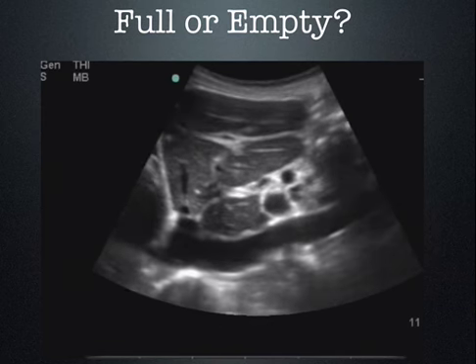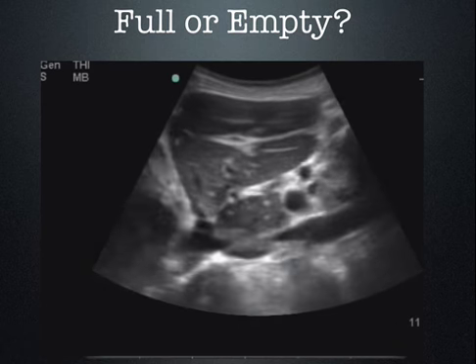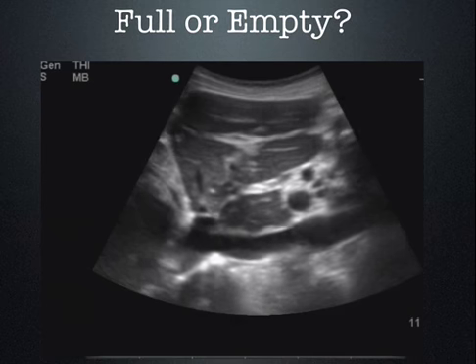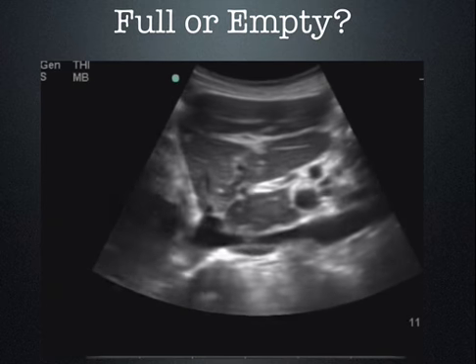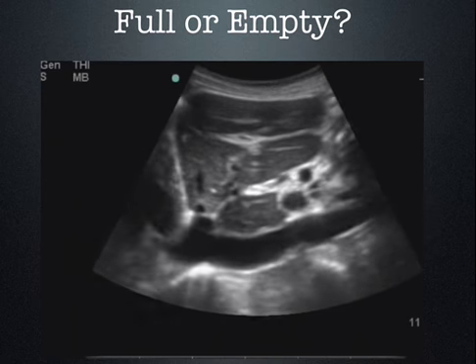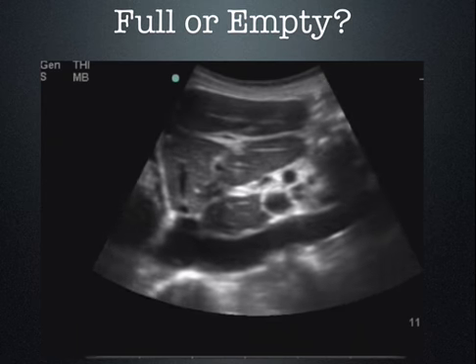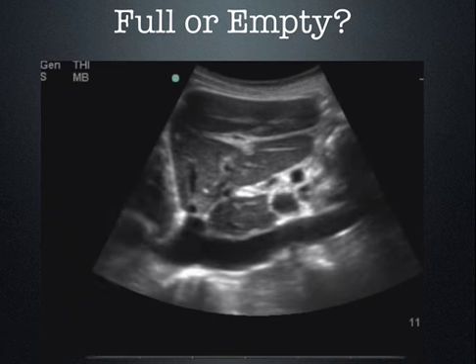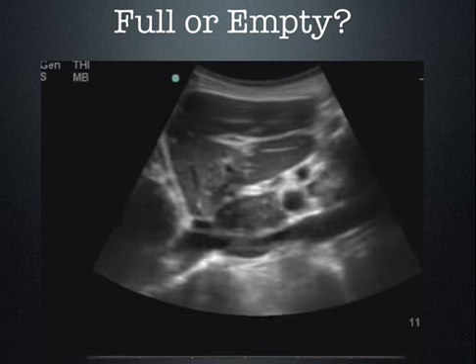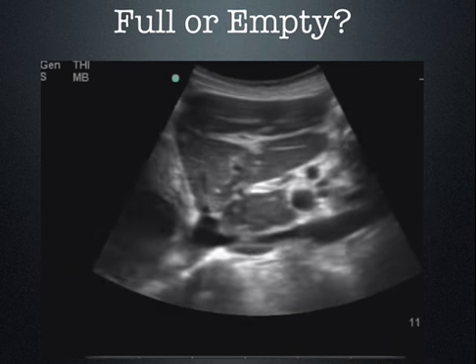Now you're going to see this from time to time. In fact, those of you that scanned with me yesterday over in the room there, we saw this on our model. Pretty highly compliant. I don't know, this is probably about 50%, 60%. Notice I'm not taking measurements, I'm just eyeballing this, and that's all I would ever expect anybody to do. It's very simple. We're not taking measurements with a spontaneously breathing patient. These are all spontaneously breathing patients, by the way.